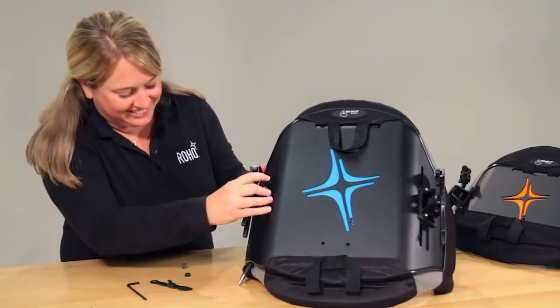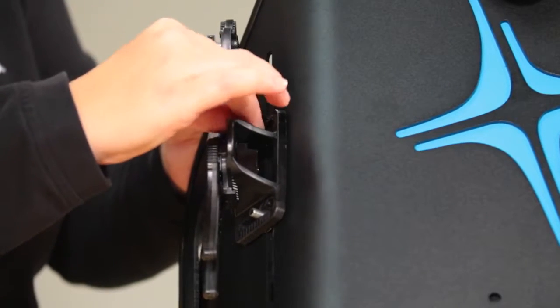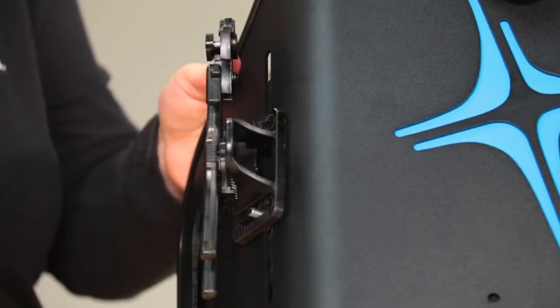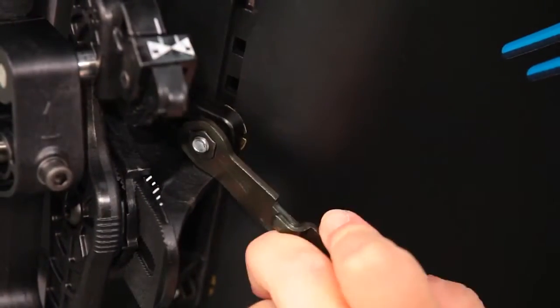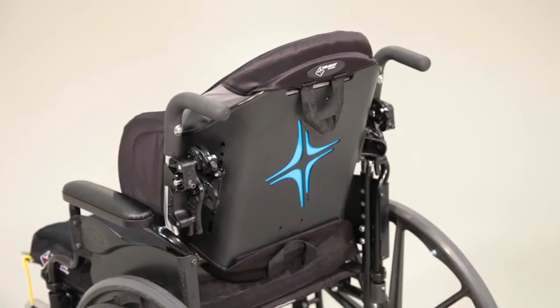With the left and right back shell hardware positioned at equal heights, tighten the nuts so that they are snug enough to hold the hardware in place. Tighten the nuts on the width and height adjustment bolts with the box end wrench until snug, plus a quarter turn. Once adjustment is complete, make sure all hardware is securely tightened before the individual is seated in the wheelchair. Now you can put the backrest on the wheelchair.